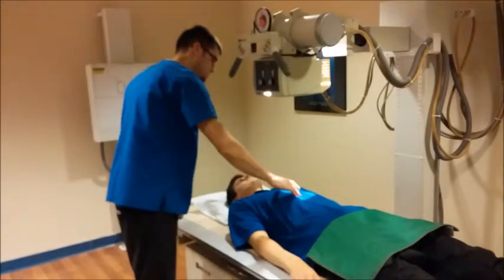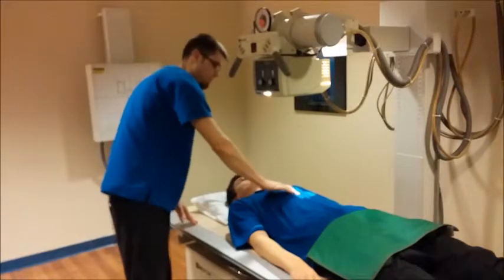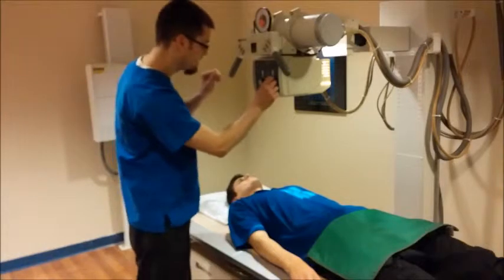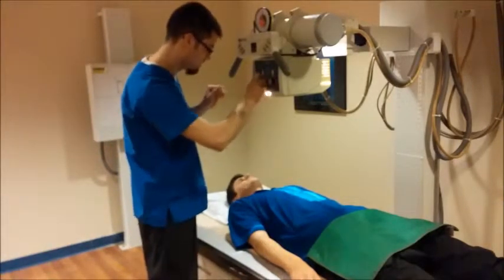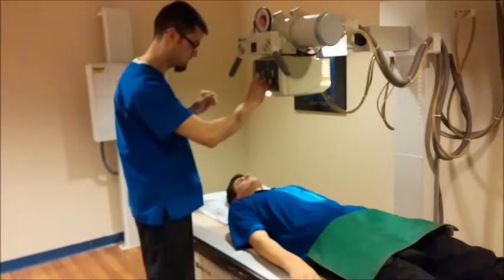Again, the central ray goes through the mid-sagittal plane. Find that by finding the xiphoid tip. And then for collimation, we want to open this up to a 17. And side to side will be about 10.